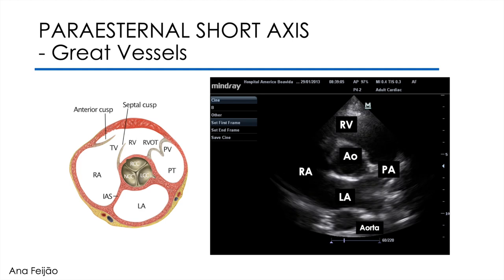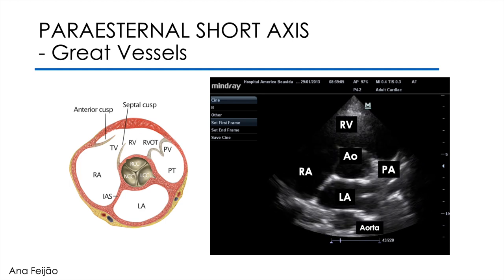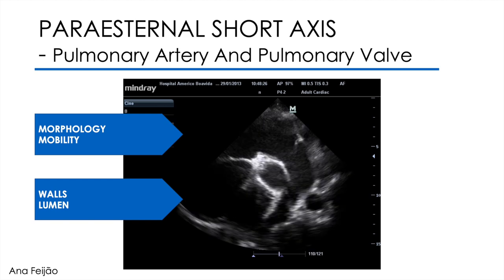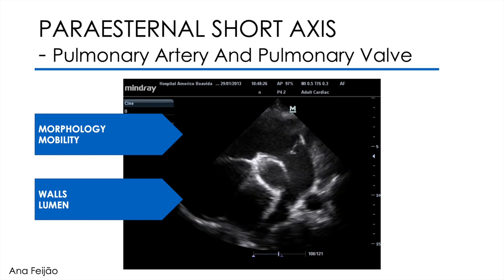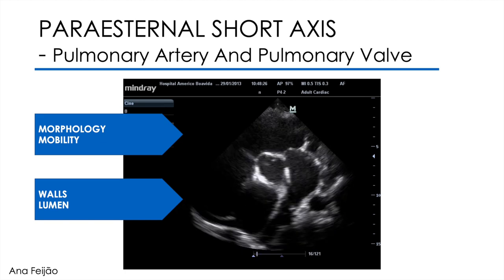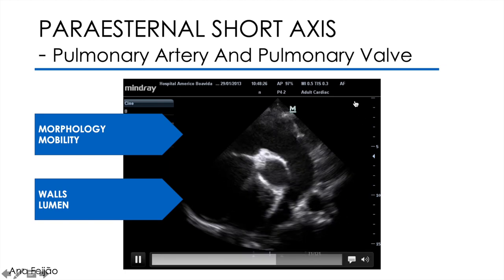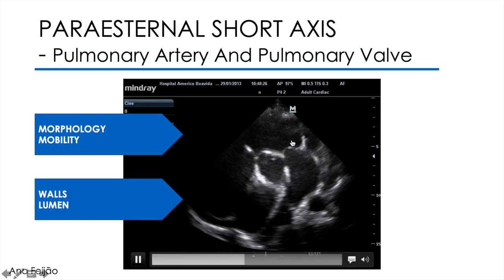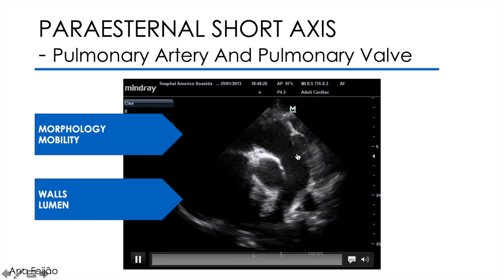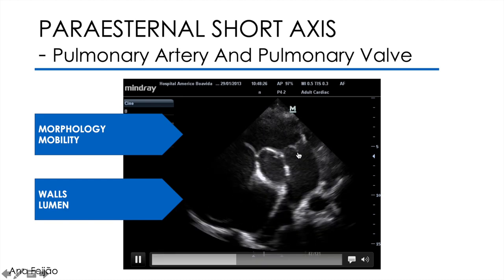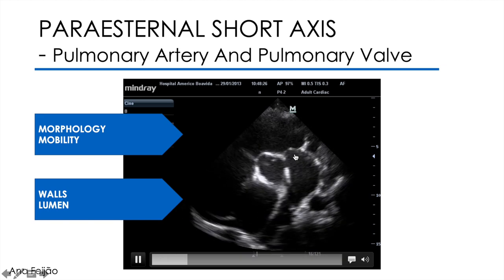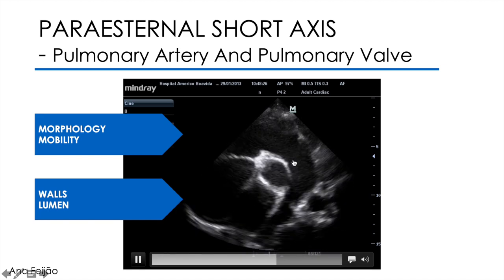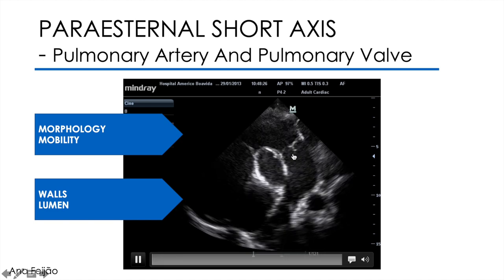Personally, I start by evaluating the pulmonary artery and the pulmonary valve. I center the structures and access the valve first. When the pulmonary cusps are very thin, they are not noticeable in systole, but we can clearly see the closing zone. Some people pass the M-mode cursor over the valve because in some pathologies the leaflet mobilization pattern varies, and the M-mode is a good instrument to evaluate. But I confess that I do not include this evaluation in my day-to-day practice.